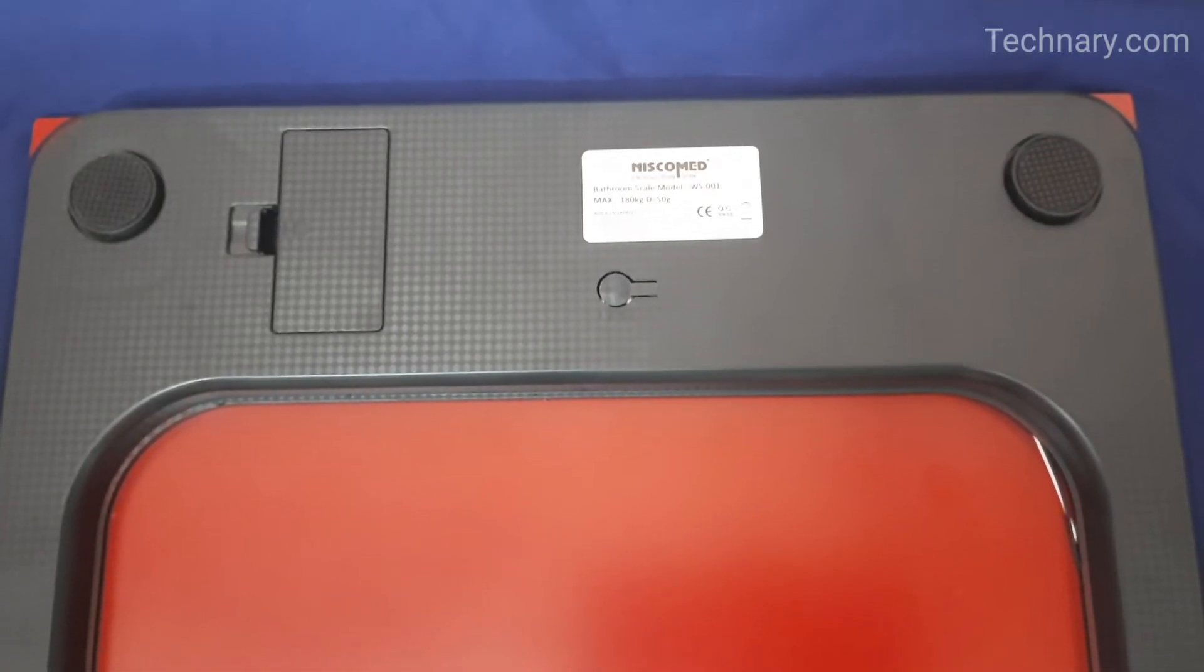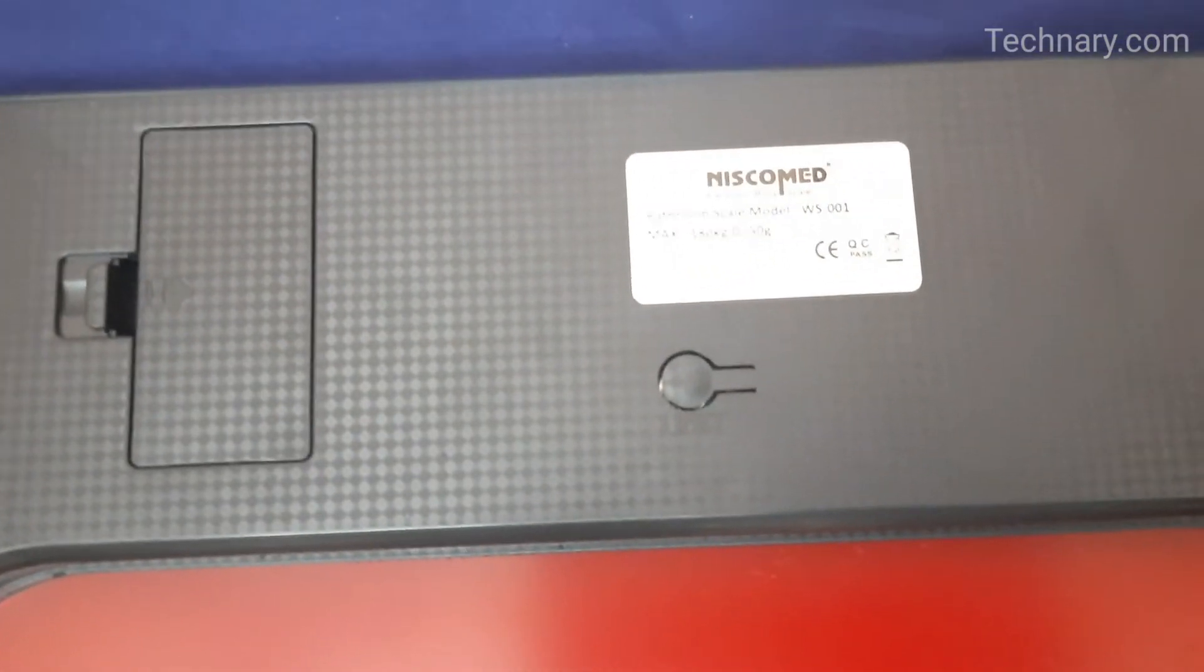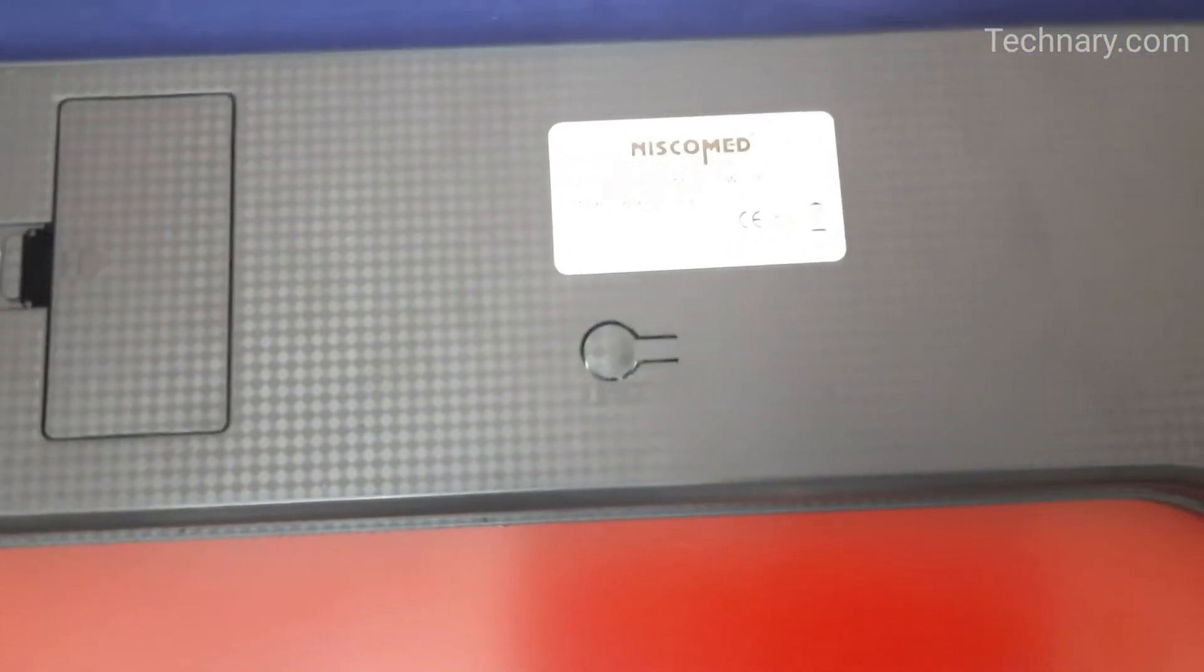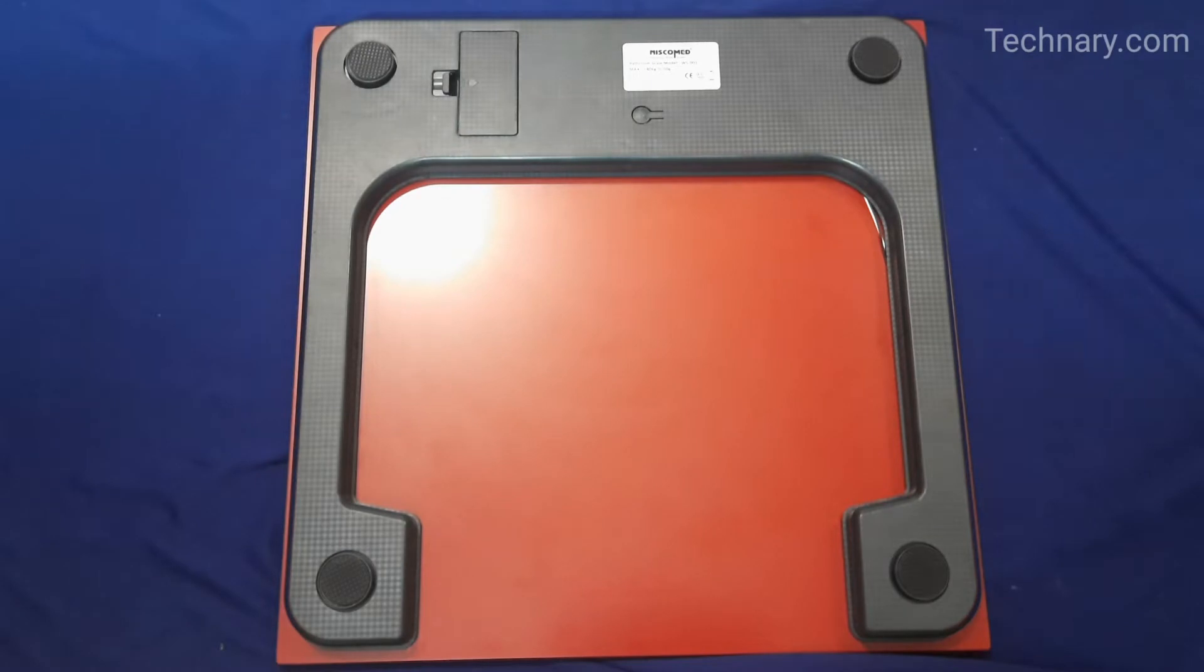This is the back side of the weighing scale. This is the slot for inserting the triple A batteries. There's also a unit button as you can see. When switched on it will switch between the units that is from kg to LBS and back and forth.